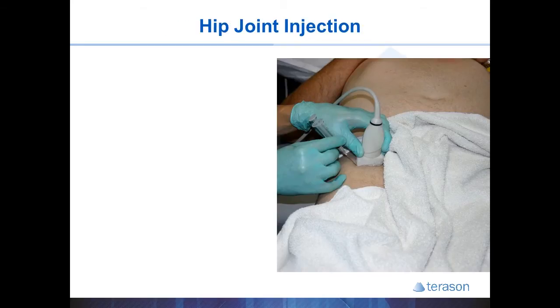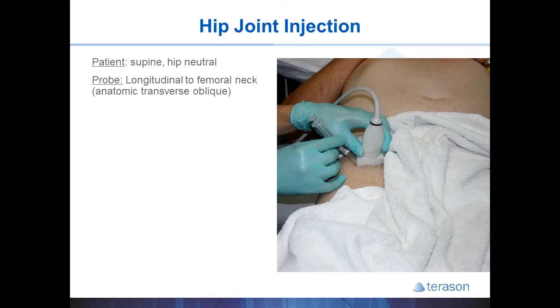The hip joint is probably one of the more difficult injections you might perform. You place the patient supine with the hip in a neutral position. The probe is placed longitudinal to the femoral neck, ending up in an anatomic transverse oblique plane — the femoral neck is usually at about 30 to 45 degrees oblique from a true transverse position. If you can't find the target image, start over the mid-thigh over the femur where you'll see the femur in transverse view, then trace it proximally until you see the contour change at the greater trochanter level. Keep one end of the probe anchored to the trochanter and rotate the other end towards the navel until the femoral neck comes into view.